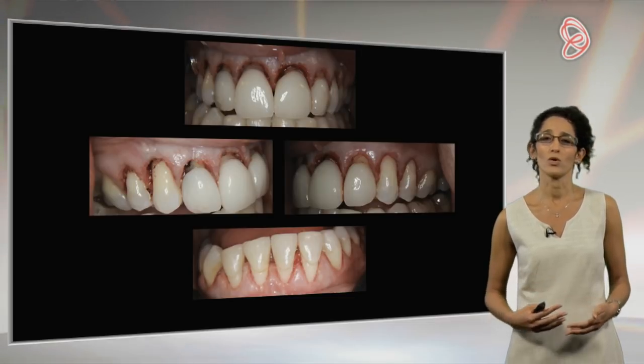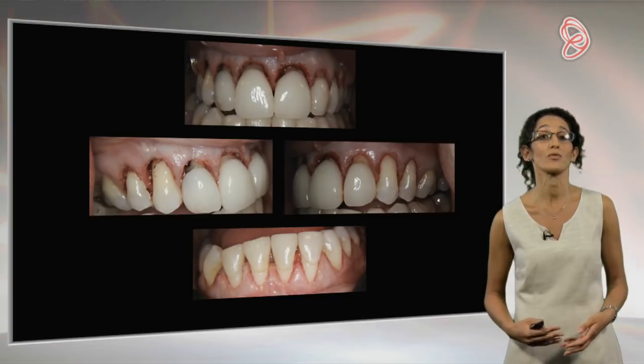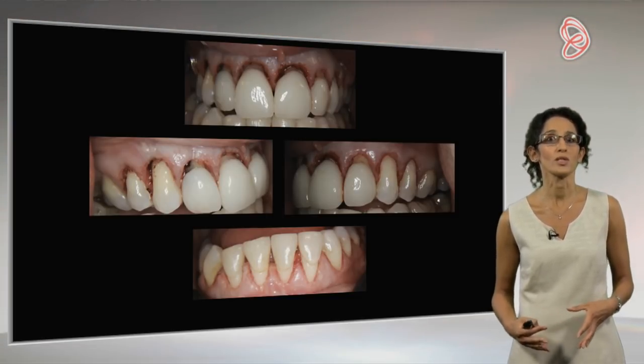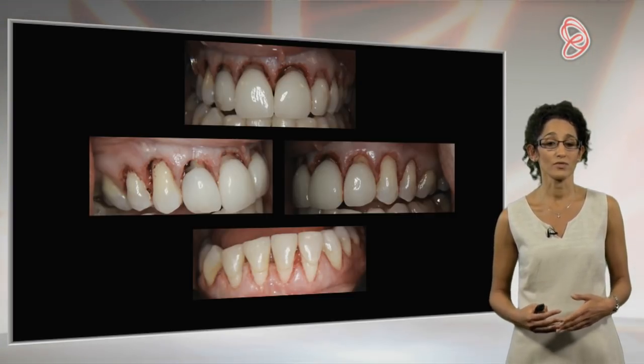And when we do that, we always feel with instruments afterwards to make sure that we haven't produced any craters or pits, or that the bone is really nice and smooth at the end. So you can see the top diagram, that's the front view.